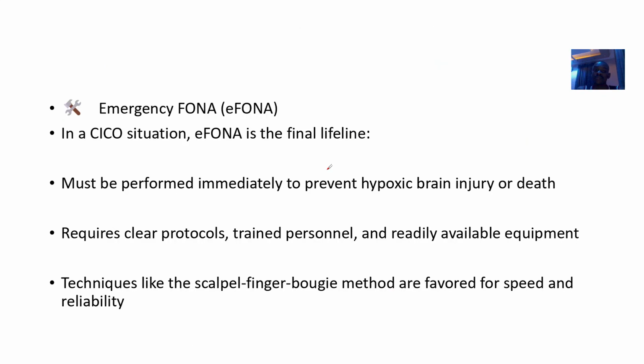Okay. So in cannot intubate, cannot oxygenate situations, all right, this FONA, that's front of neck access, is like the last option you are going in for. All right, you have tried to intubate, you have tried to mask up, it has failed, so you want to just access the neck directly. So it must be performed immediately to prevent what? The case where oxygen supply to the brain has depreciated to a very long extent.